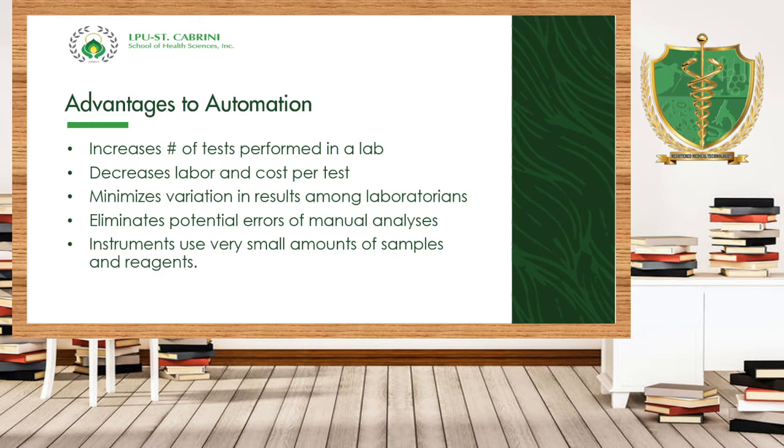Okay? Next is decreased labor cost and cost per test. Not really a significant advantage for automation because, like what we have said, human power or manpower will always be there. Yun nga lang, the number of duty or the number of staff na mag-duty in a certain shift can be lessened. Unlike if you will have the full manual technique and you will need approximately at least two medical technologists doing the test.